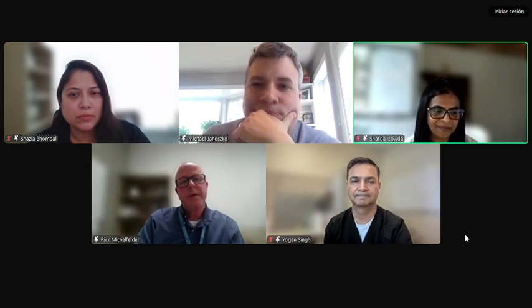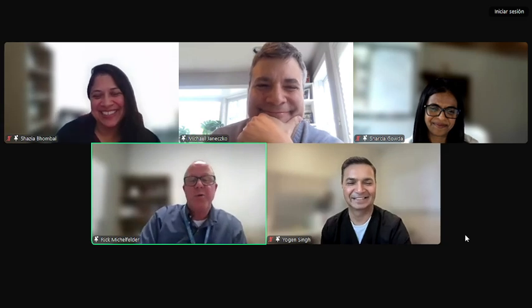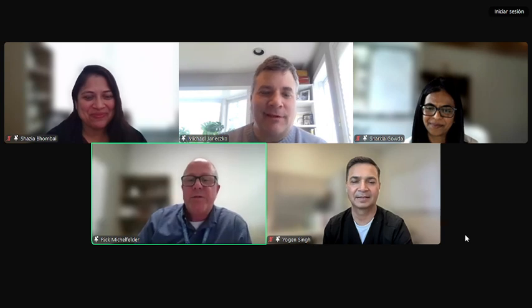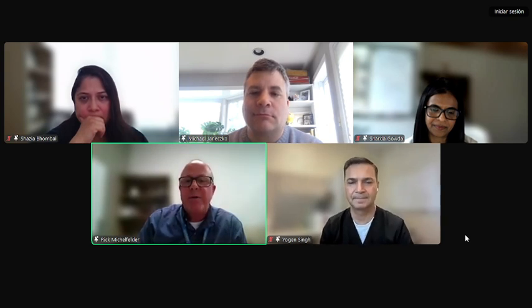Thanks. Yeah, I don't start UVCs anymore. It's been a very long time. So you wouldn't want me starting a UVC with or without an ultrasound machine. But I will offer that in terms of systems, the laptop size ultrasound systems are reasonable to consider for programs that are building a POCUS program. It's a lower price point, but more functionality than some of the handheld units. And we use one for our codes in the CICU, for example, because it sits on the wall and unplugs, and the battery's charged, and it's got a good long battery. So something to think about.